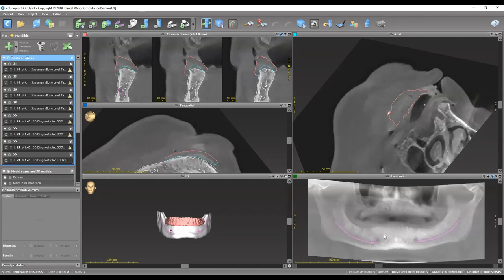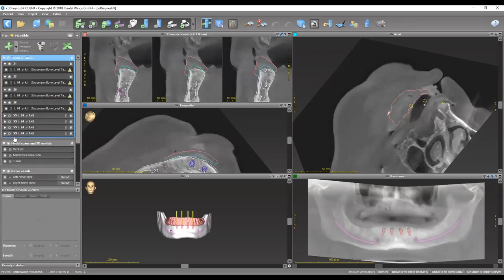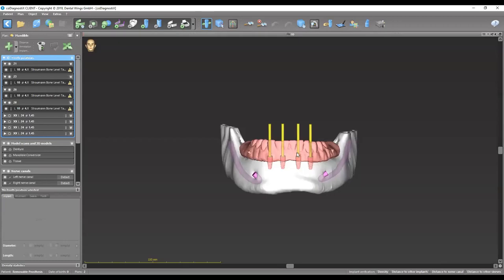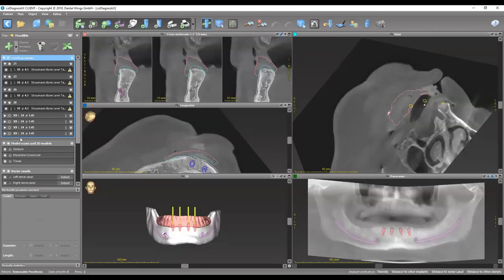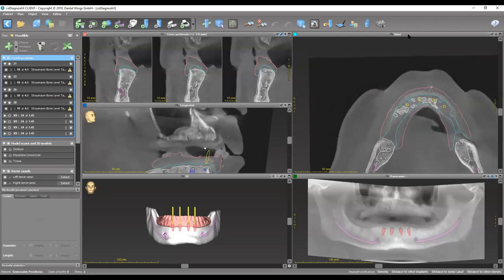What we're going to be doing today is placing four implants using Straumann. This is how the scan looks — this is the patient's denture, and you can see the radiographic markers stuck on the denture. Before going into the planning part, I want to show you how this is registered to the scan so you know how the stitching goes.